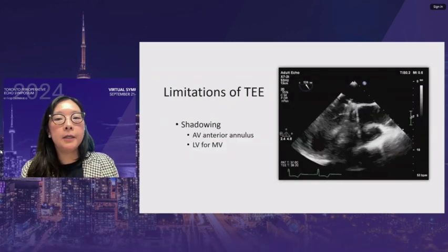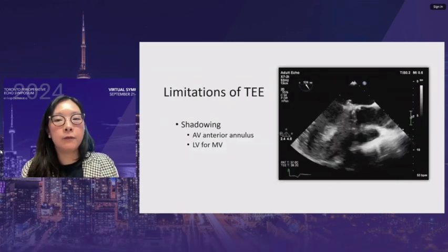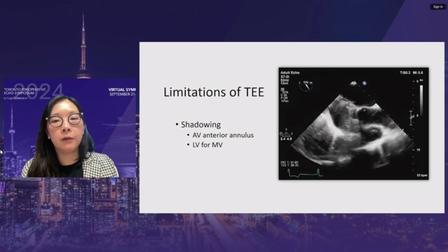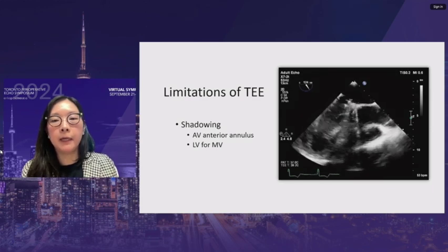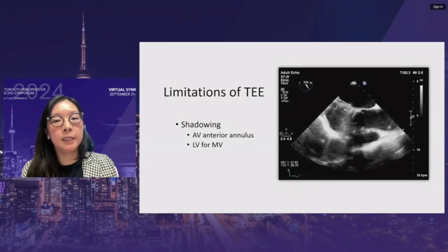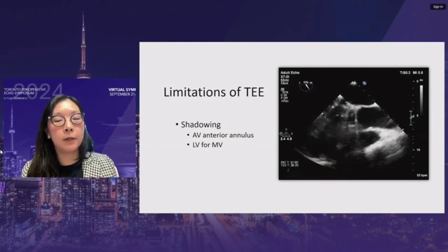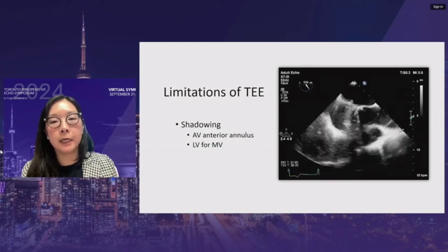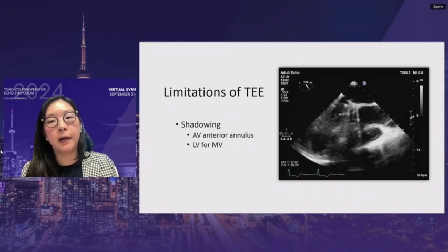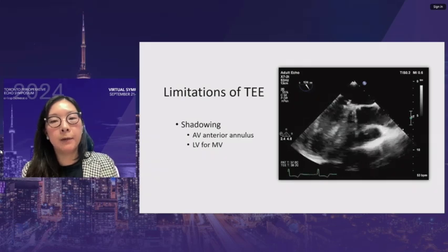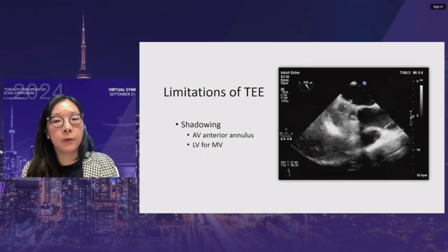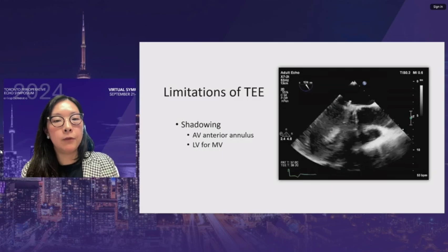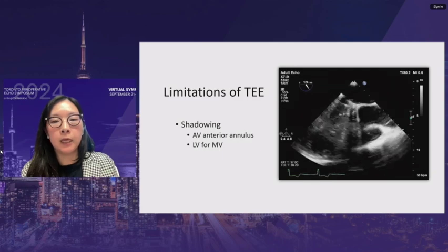With a prosthesis or artificial material in place, shadowing occurs. The anterior aortic valve annulus may not be well visualized. A mechanical mitral valve also causes the LV to be poorly seen on mid-esophageal views. For the mitral valve, a transgastric view is required to assess the subvalvular apparatus.